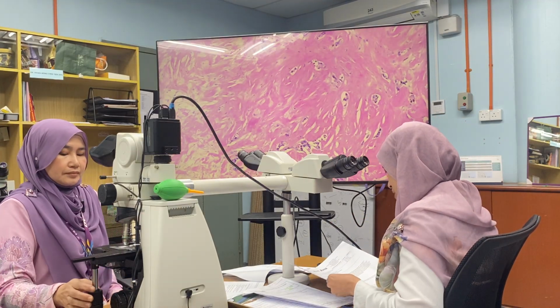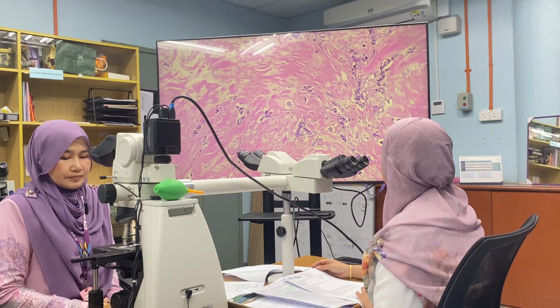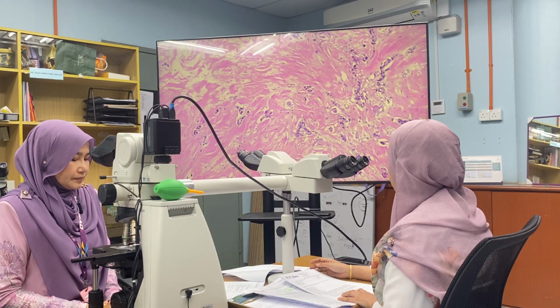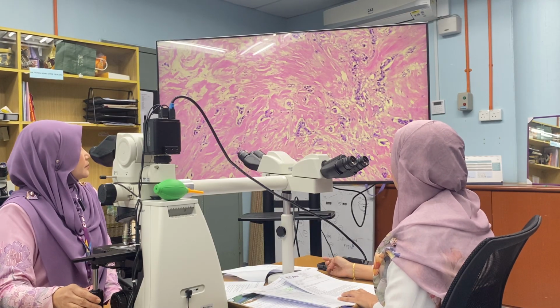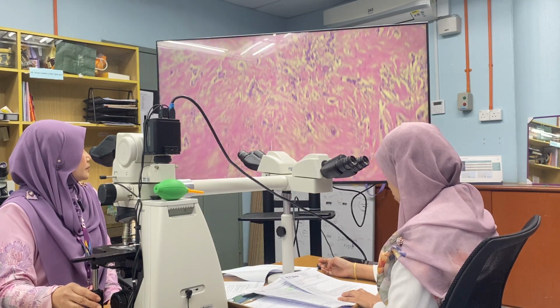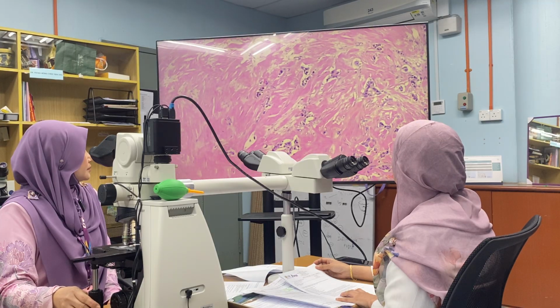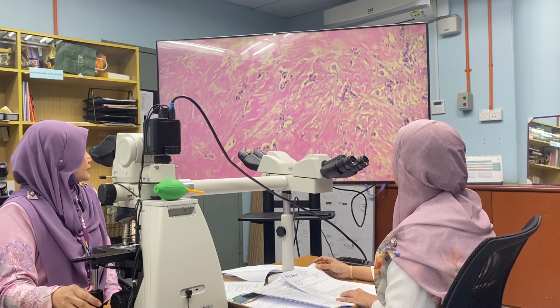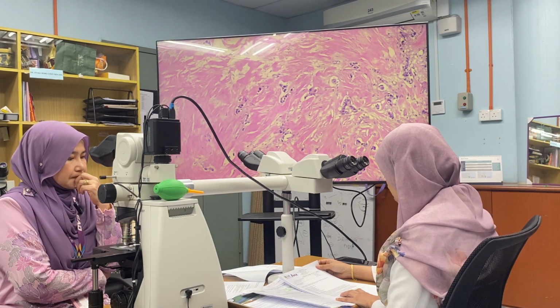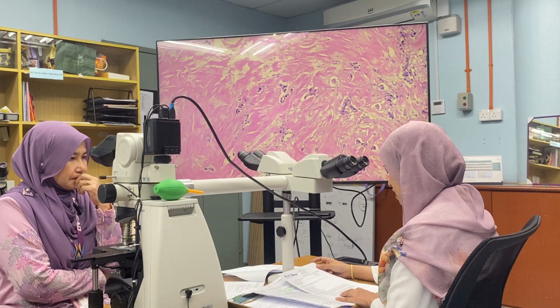this breast specimen shows viable malignant cells within the fibrotic stroma. The malignant cells are arranged in cords and single nests with minimal tubule formation, which I score as 3. The cells exhibit moderately pleomorphic nuclei with prominent nucleoli and a moderate amount of cytoplasm. Mitosis, I counted, is 3 in 10 high power fields, which corresponds to score 1.